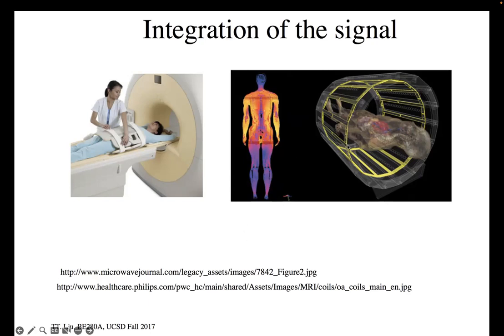You could also use this coil to receive the signal that's going to come back from the patient, but because the elements are far away from the material that's generating that signal, because this distance is pretty far, you lose a lot of intensity just by 1 over r squared, right? And so normally for the receiver part of this, you put loops of copper very close to the patient, or as close as possible.